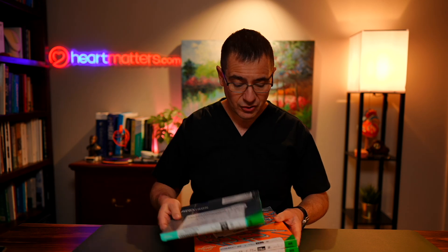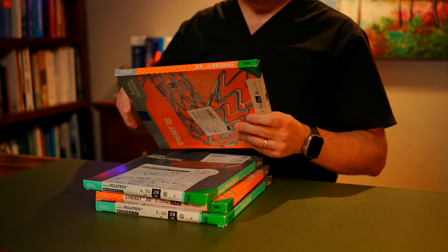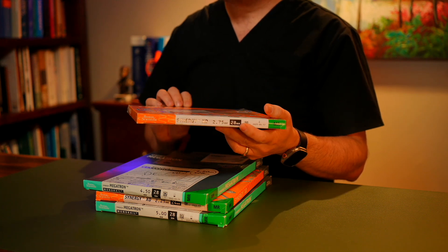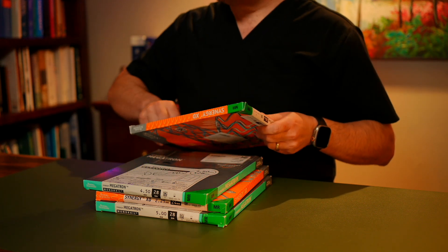When your doctor finds the problem and asks for a stent, the nurse will bring out a stent from the cupboard, and it comes in a box like one of these. Each of these boxes is sterilised, and I'll go through a bit of an unboxing to give you a glimpse of the stent itself. We'll open up this stent here, which is a Synergy — made by Boston Scientific — it's a 2.75mm diameter by 28mm, and there's quite a bit of packaging involved.